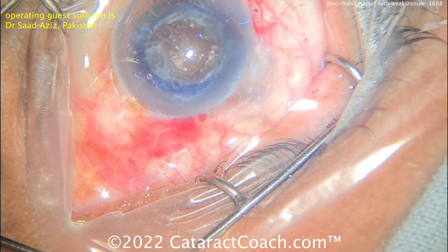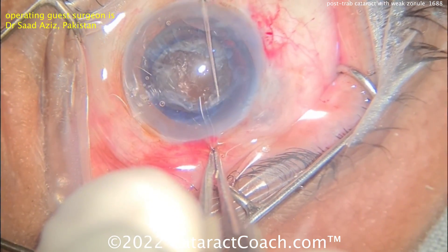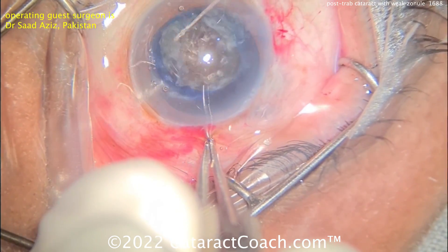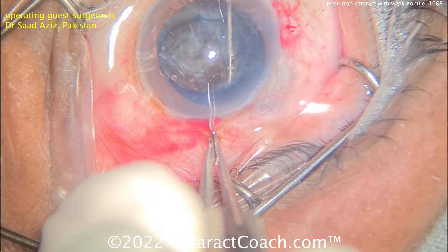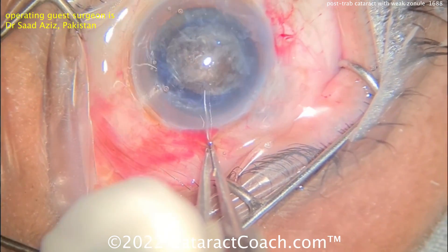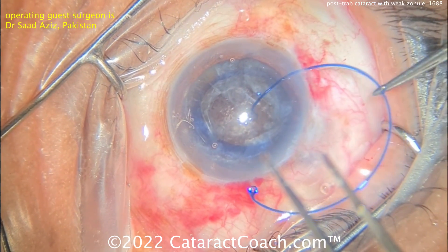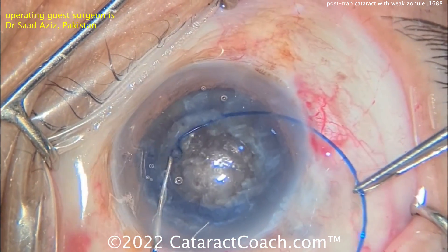A little bit of hydrodissection coming across here. Now using a hook on the side port to rotate the nucleus — look at the movement, look at the rhexis edge. Why does the rhexis edge move so much? That's the giveaway sign. Totally agree — at this point, get that CTR in the eye. That movement of the rhexis edge is indicative of a problem here.